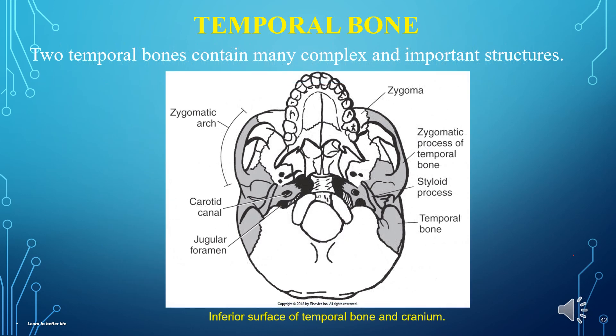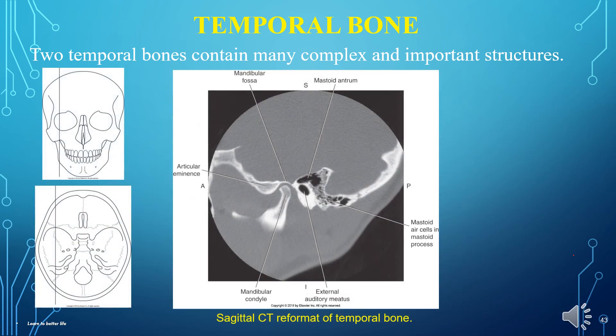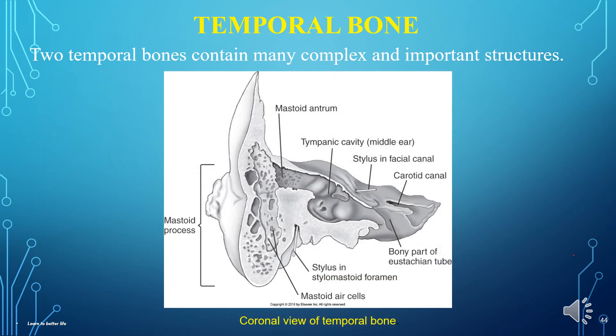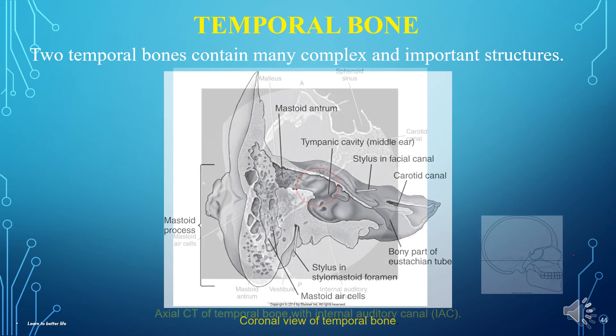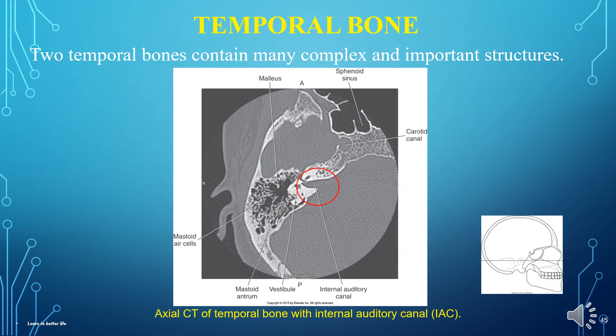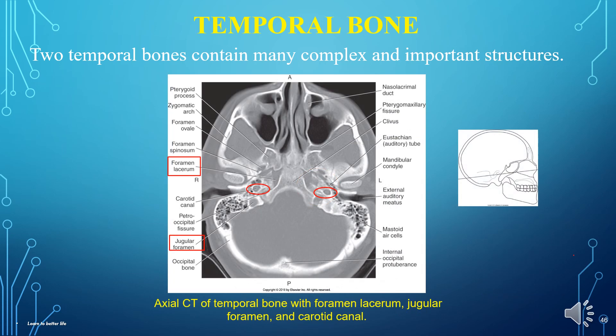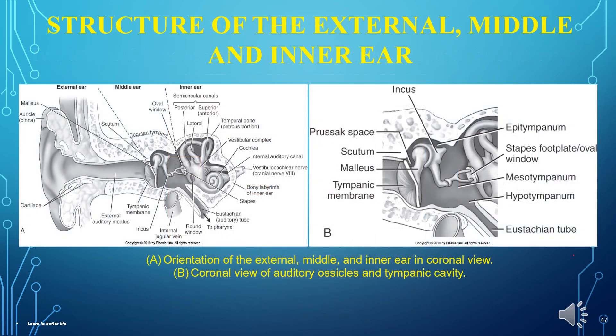Many cranial nerves and blood vessels pass through the temporal bone. Injuries to this bone can cause loss of function in the facial muscles, as well as hearing loss and heavy bleeding. This is the inferior surface of the temporal bone and cranium, the sagittal CT reformat of the temporal bone, and the coronal view of the temporal bone. Another view is the axial CT of the temporal bone with the internal auditory canal (IAC).